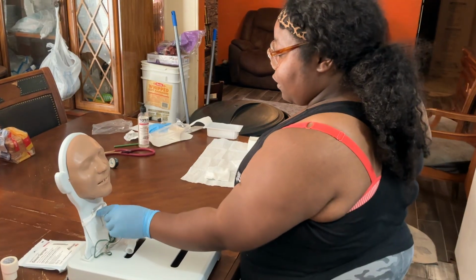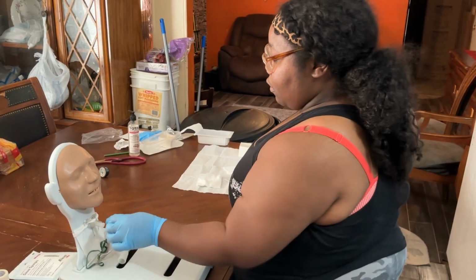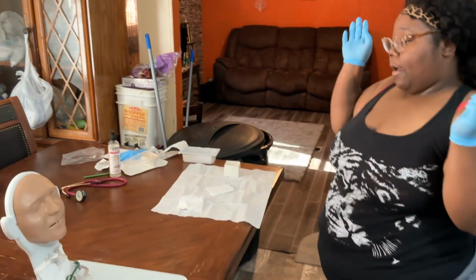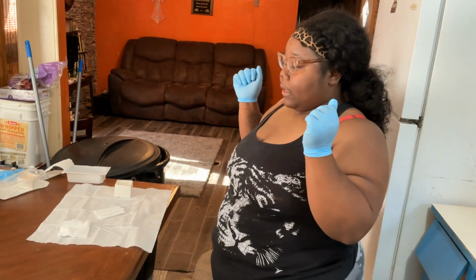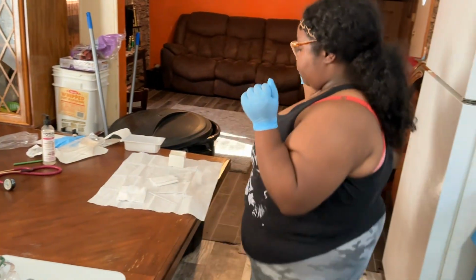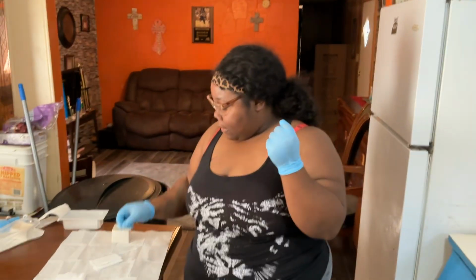Okay, I'm going to reach over my sterile field. Alright. Now, my glasses are falling. I apologize. Now what I'm going to do is go ahead and clean around my trach. So I'm going to take this.